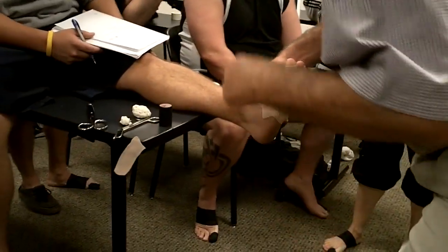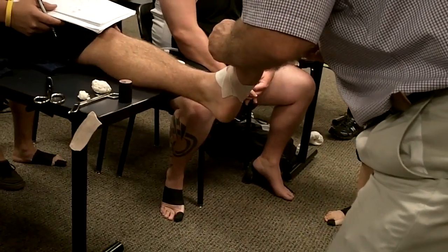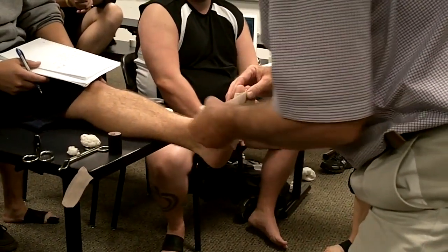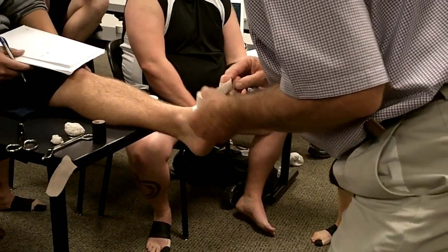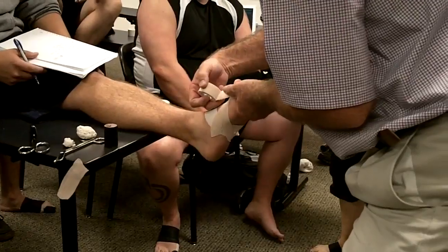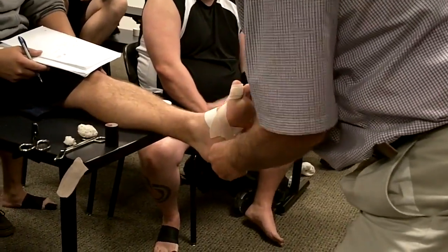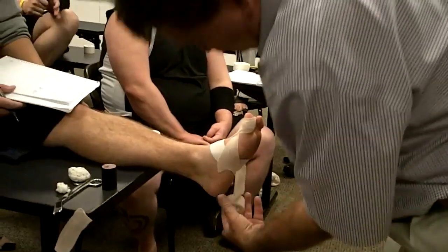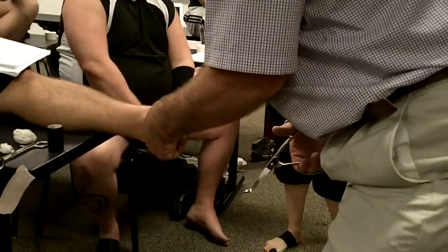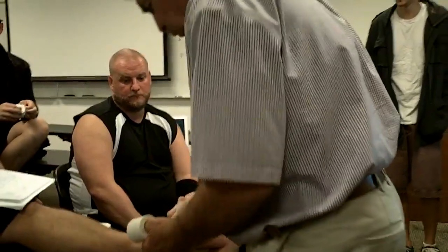I can do a continuous piece if I want. I'm going to pin it, take the stretch out, relax it around the big toe. I overlap a little bit so it's not exactly the same. I pin it here, take the stretch out, and I can finish here. I typically don't like to finish the tape at the bottom of the foot because you've got to step on that and most people feel it. I'd rather finish my tape edge on the top so when they step, they don't feel it.